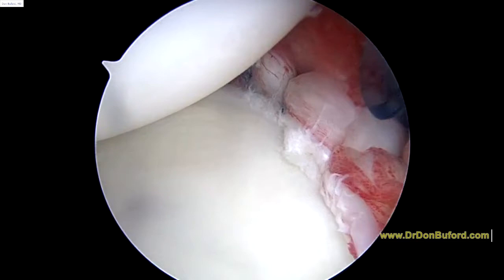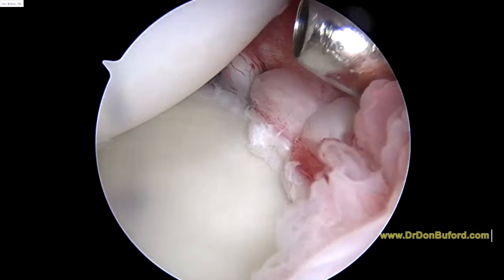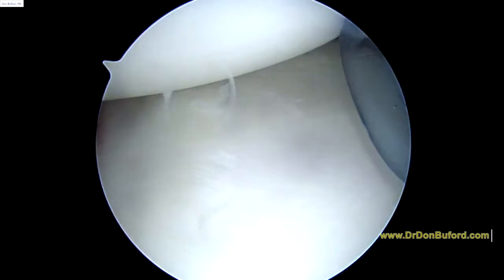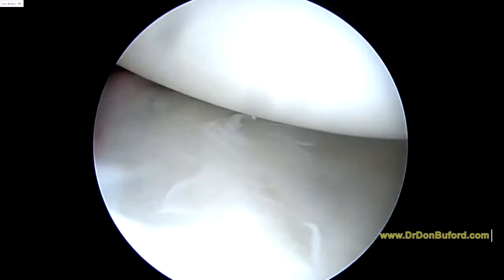So we've tied all four sutures here. You can see how we've got a much more defined posterior band. We've significantly decreased the capsular volume, and that looks a lot better to me. Hopefully that will provide the stability we need. As we look down the front, you can see the anterior band of the inferior glenohumeral ligament — that looks reasonable. I don't think I'm going to do anything to that.